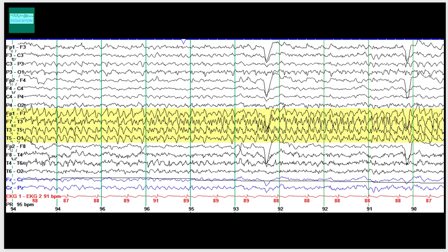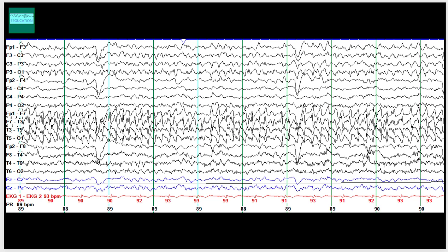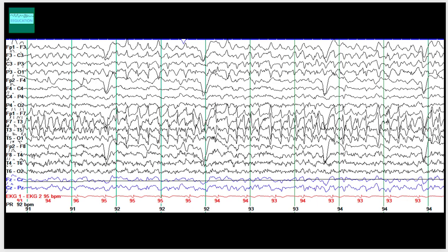On this page, you can see a very clear asymmetry between the left and right hemisphere. The seizure in the left temporal head region has evolved in frequency — now you can see a lot of fast frequencies intermixed with the underlying theta activity. There is some spread into the parasagittal region, which is somewhat more prominent here. The frequencies are starting to slow down, but the superimposed fast frequencies persist. There is slowing in the right hemisphere as well, but there is definitely an asymmetry, as the seizure is lateralized to the left temporal head region.